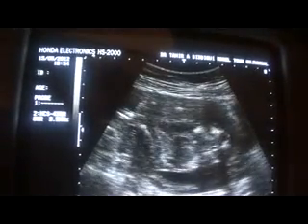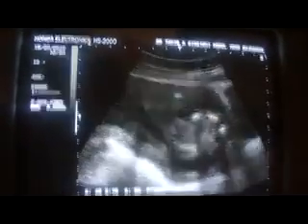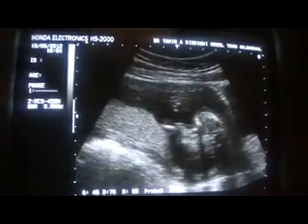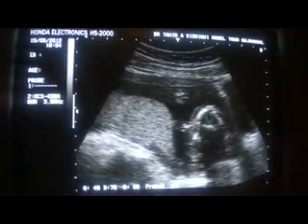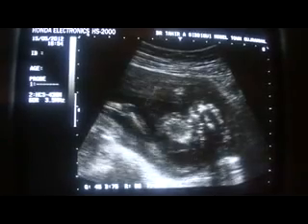Let's see, this is a 16 weeks pregnancy. Femur length is 2.2 centimeters, and that corresponds to the gestational age of 16 weeks.